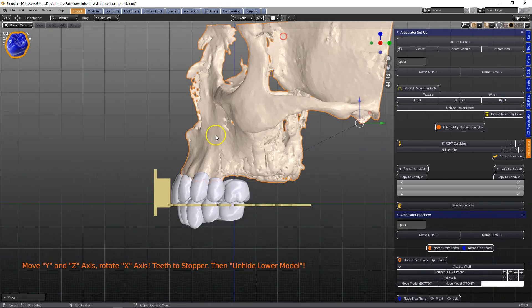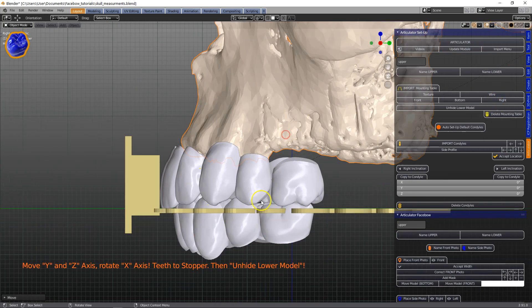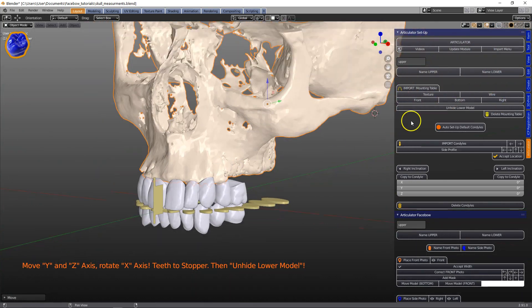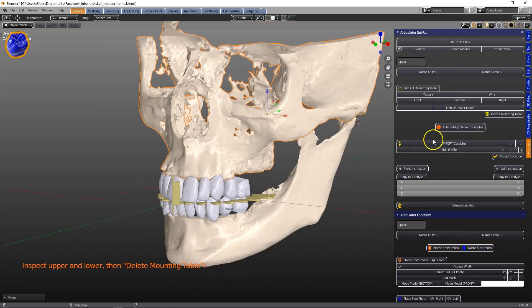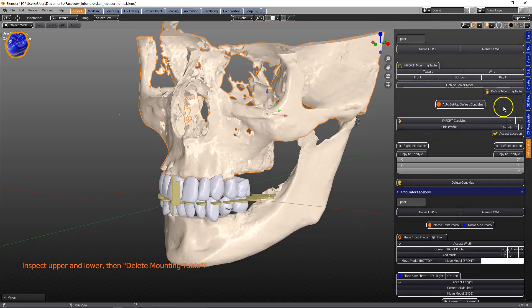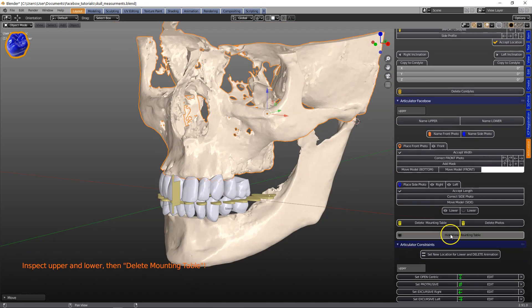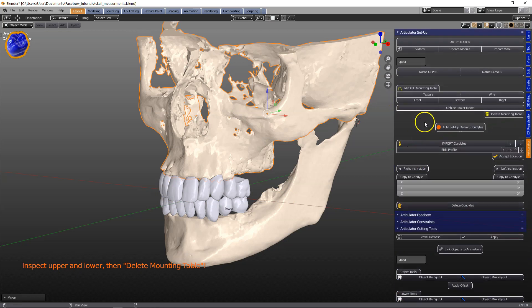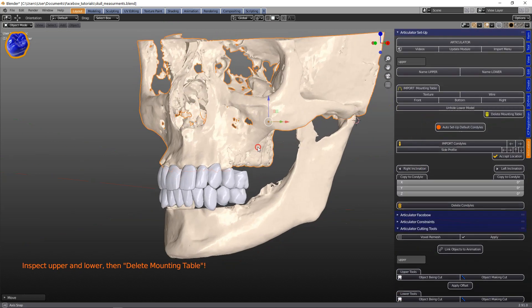Then we're going to view it from the right-hand side, and this is looking exactly right. Unhide the lower. Previously we needed to delete the table, but now we can just hide it if we want to.